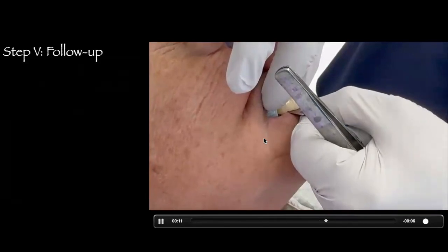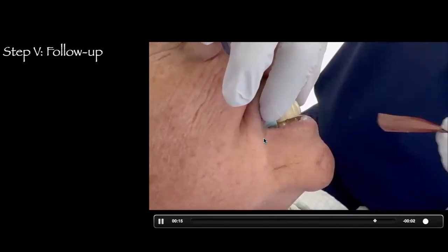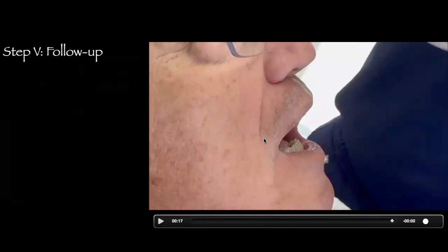You can see how I'm able to pull it out. There's just a little bit of tug, and this means that my anterior teeth have intruded while the posterior teeth have extruded. This is the reason why I take that bite registration immediately after I segmentally increase the vertical dimension. And I'm going to use the bite registration with the Regisil on posterior teeth only.